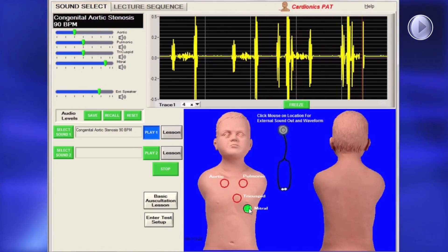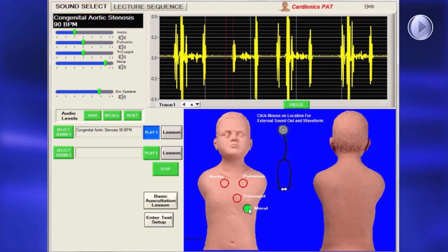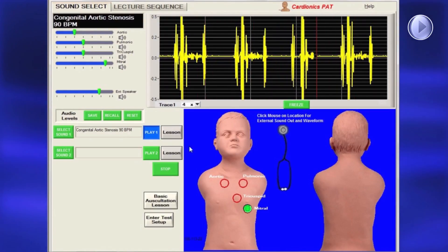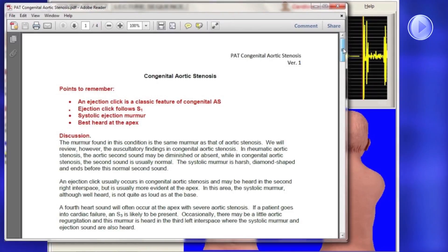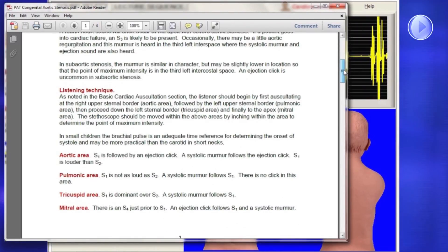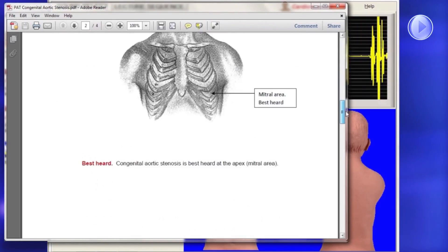PAT includes a lesson for every sound, accessed by clicking on the Lesson button. Each lesson has a description of the sound.